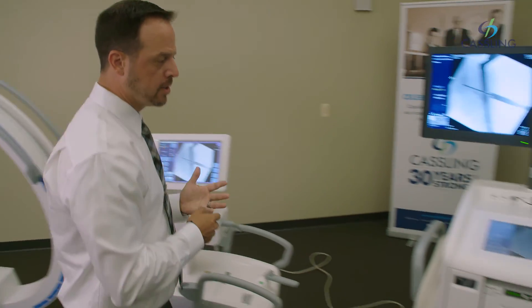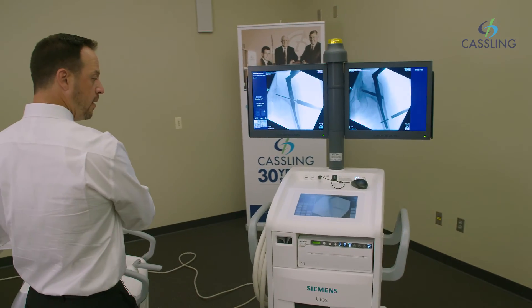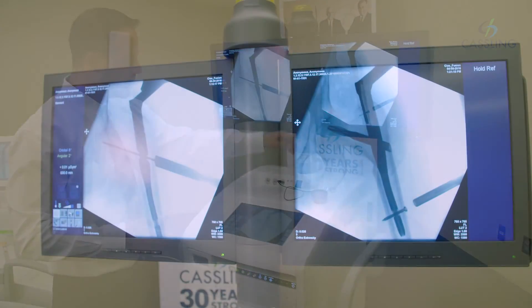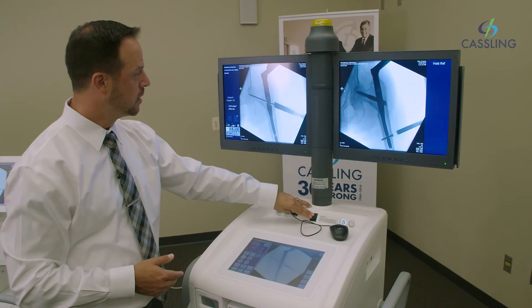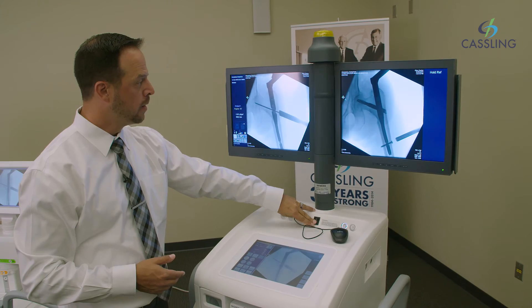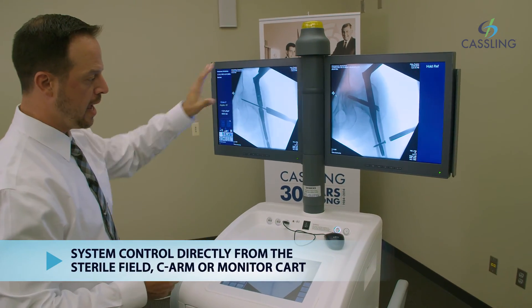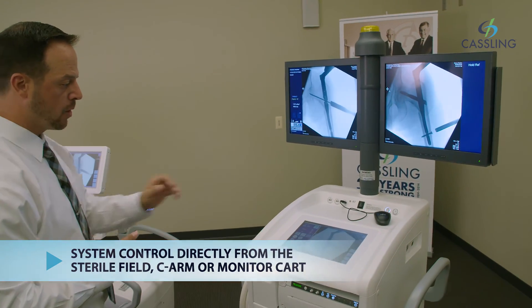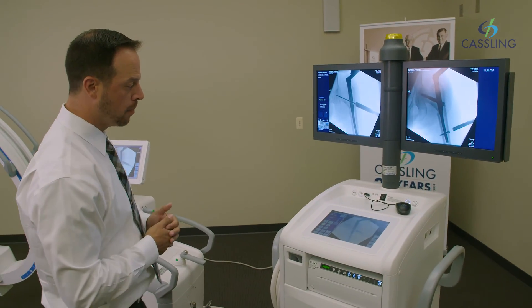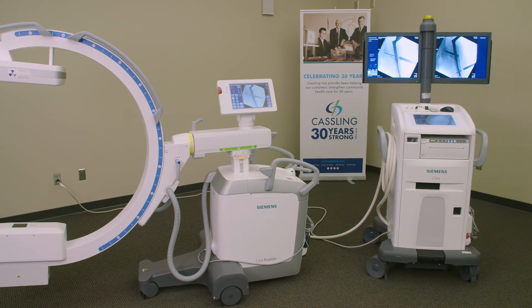As we roll over here to the monitor cart, it has the same touch control panel as at the C-Arm. You have 19-inch TFT monitors that raise and lower, and the screens rotate around so you can have them facing the physician during the procedure while the tech is operating the C-Arm from the control panel. So that's just a quick overview of our COS Fusion.